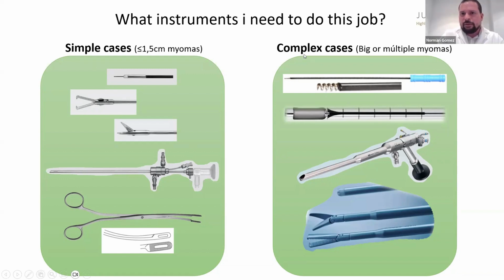And on the other hand, we have instruments for complex cases. This is what I mostly use. This is a tissue removal system device. This is from Medtronic, for example, but you can use whatever you want.